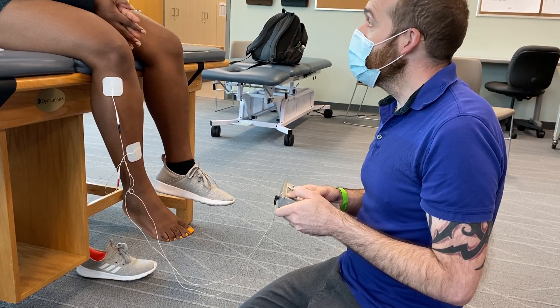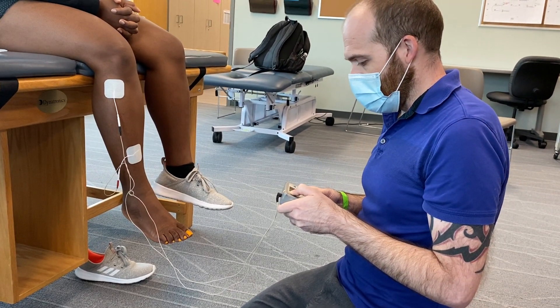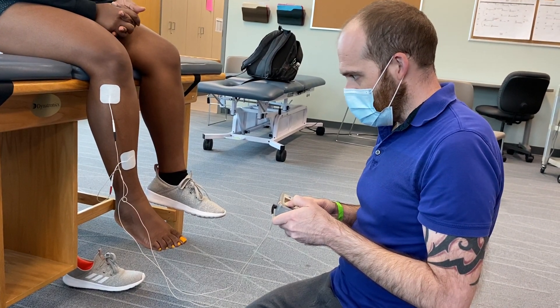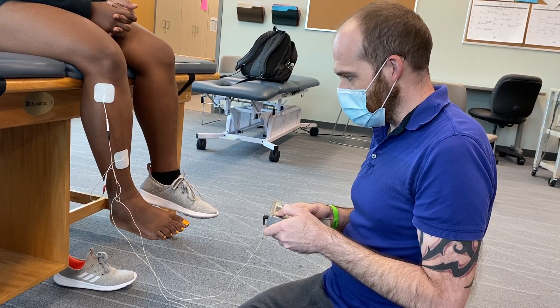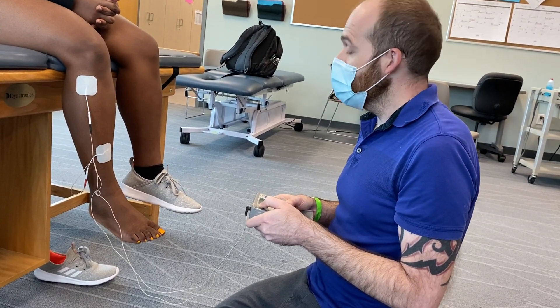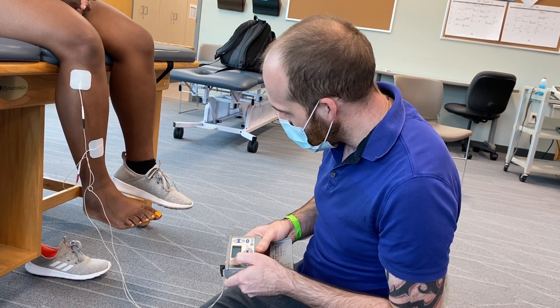Do you feel anything? Not yet. Last time you got it at 12 — we're at 12 now. A little tingling? Okay, now she's starting to move. Inversion and dorsiflexion, but less inversion. Is that painful? No, just weird. That's pretty good, and we got some toe extension there too.